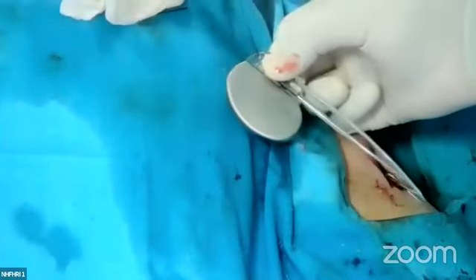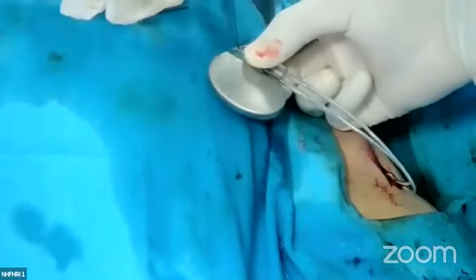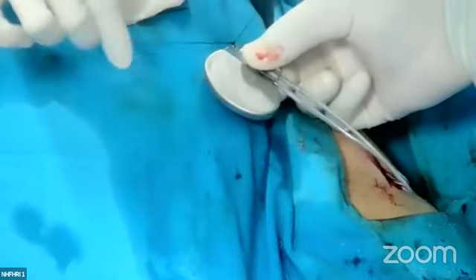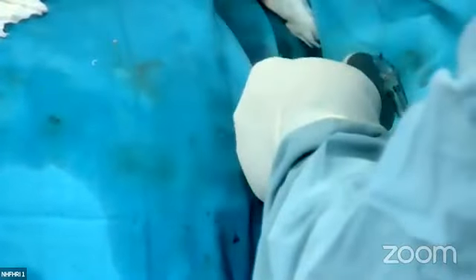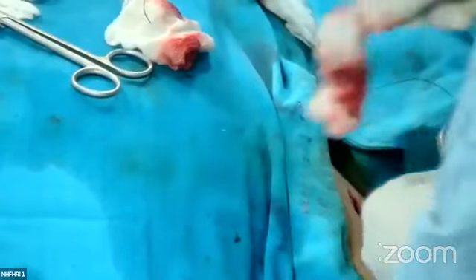In the examination, Twiddler syndrome is asked. This generator is frequently asked in the examination, sometimes given in the examination, and the parts of the generator are asked. So I am putting the generator with the lead inside the pocket.